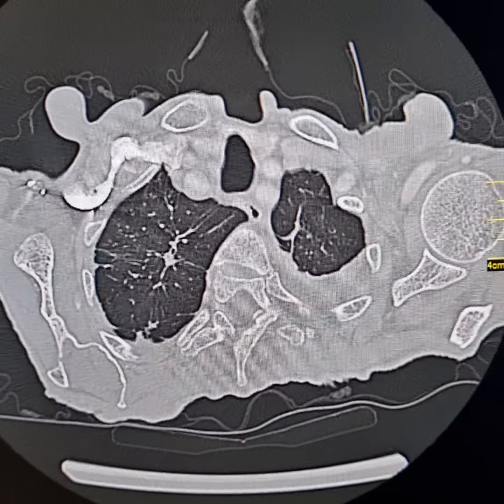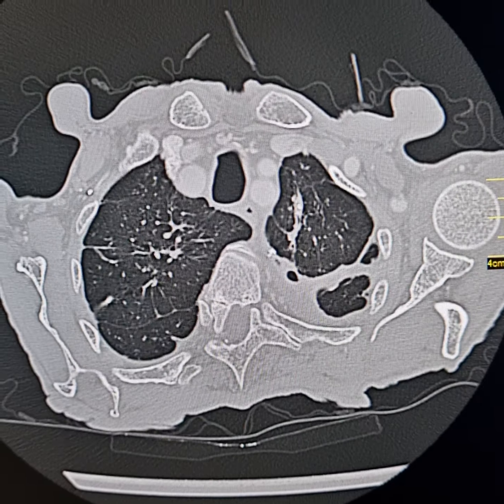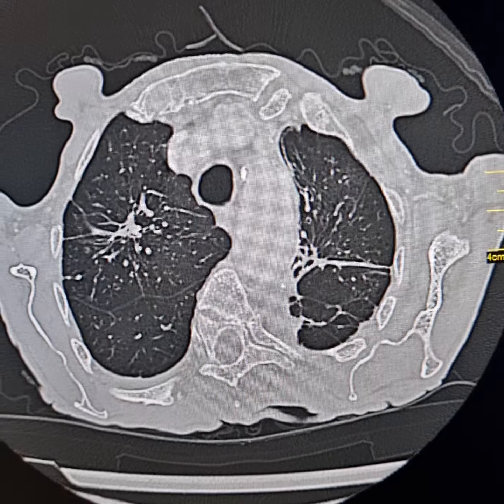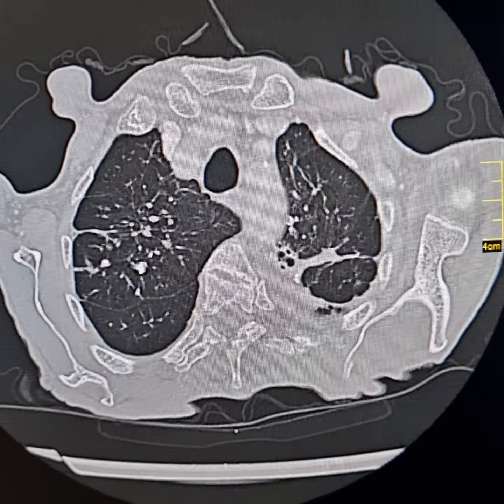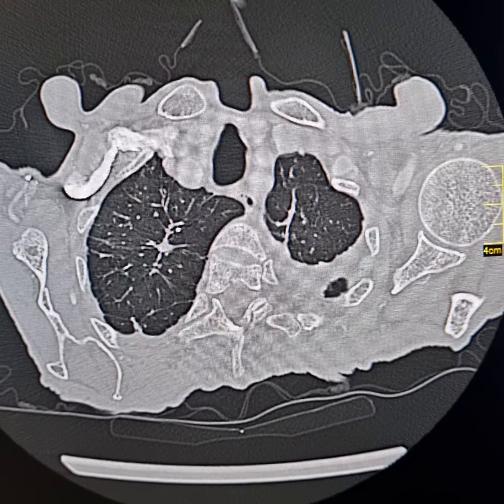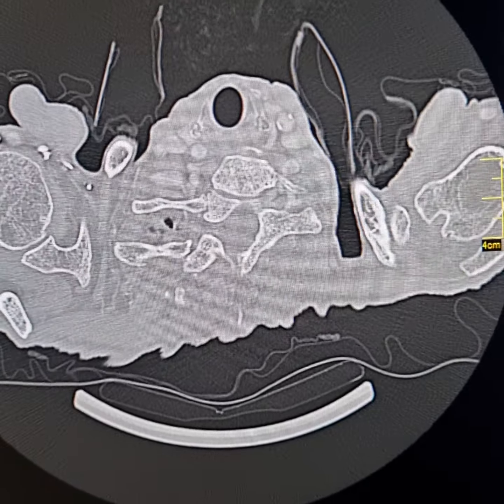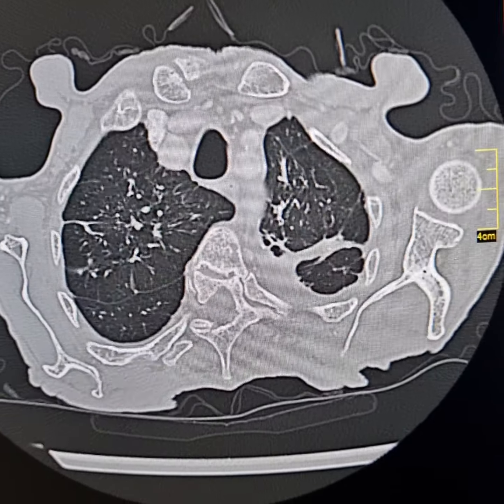This is a CT of chest, abdomen and pelvis of an aged patient. His age is approximately 87 years. There are multiple interesting findings.